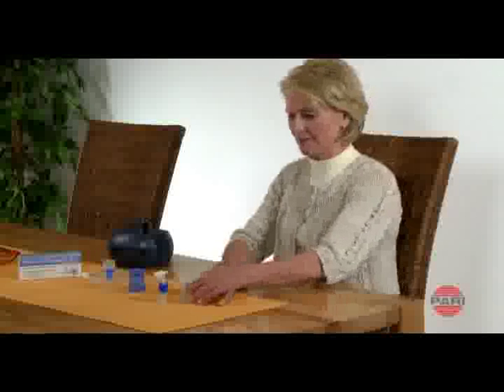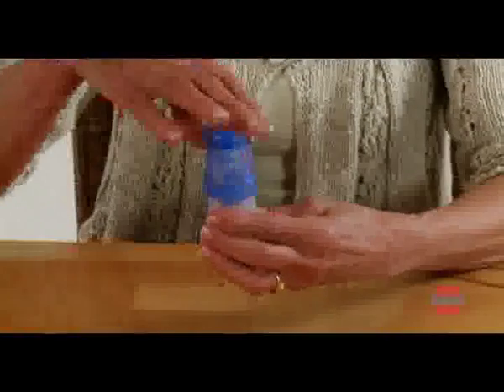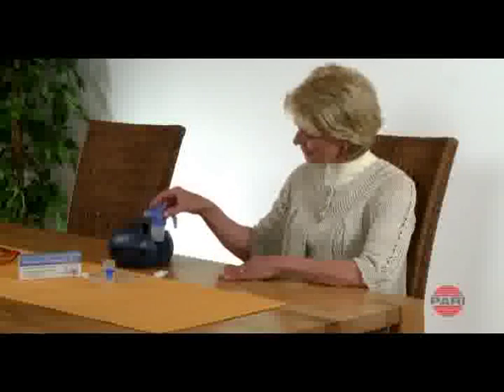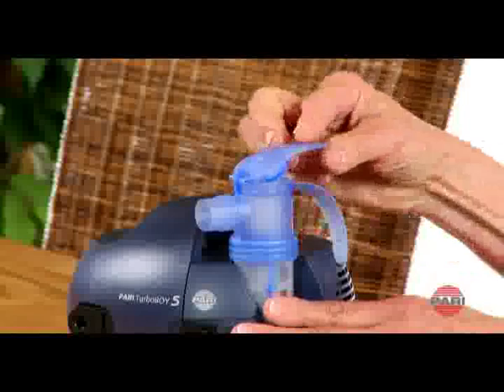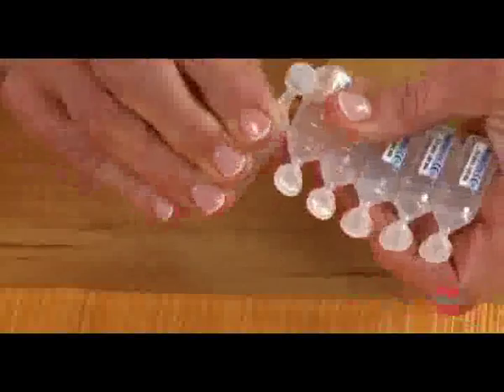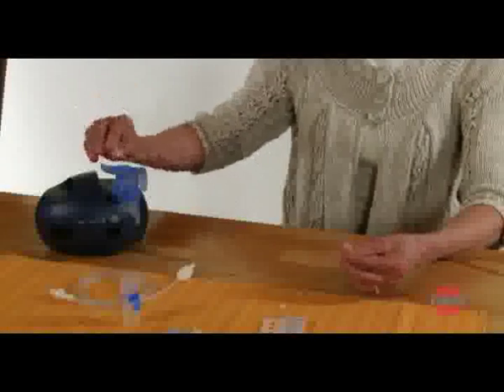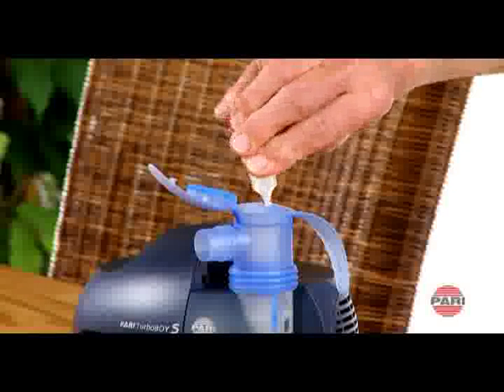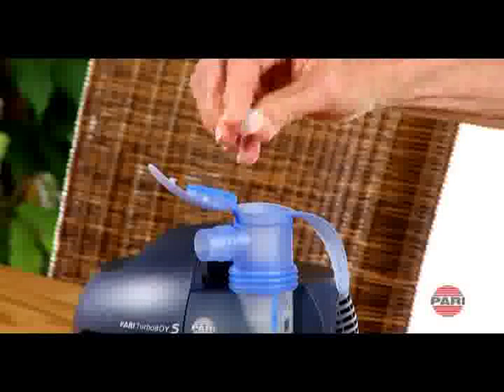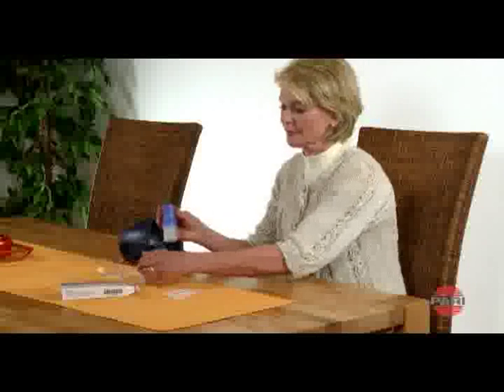To assemble the nebulizer, first push the nozzle attachment onto the nozzle in the nebulizer lower section. Screw the nebulizer upper section onto the nebulizer lower section. Open the cap on the nebulizer upper section. Fill the nebulizer chamber with inhalation solution from above. Do not fill past the maximum fill level, which is equivalent to about 8 milliliters. Close the cap on the nebulizer upper section and then attach the mouthpiece or child or adult mask.